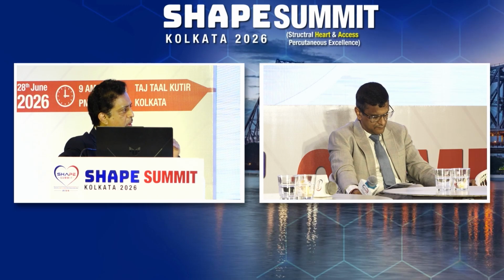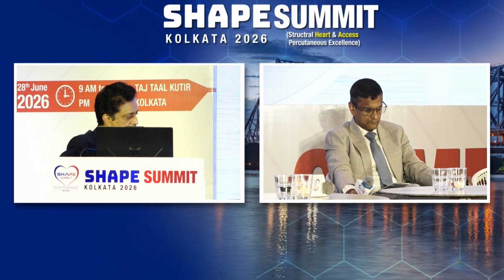Yeah, I think that's a good question. Very often you need to look at multiple things. You don't only look at the annulus, you look at all other parameters. You look at go 2 millimeter down, go 2 millimeter up. That's one. Second, you may have to add about 10 to 15% extra if you have gone in a diastolic frame. You look at the mitral valve, what's happening, how much of diastole it is. And thirdly, if you're ambiguous at that point in time, you can also do a very good balloon assessment.